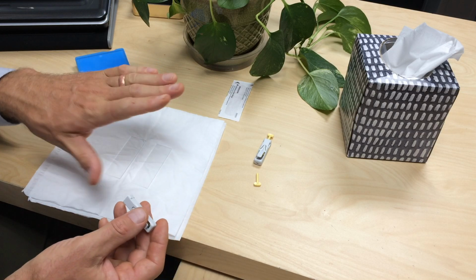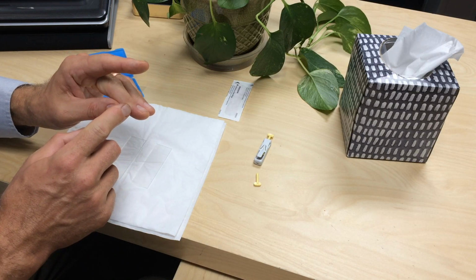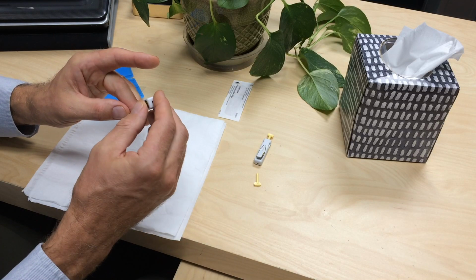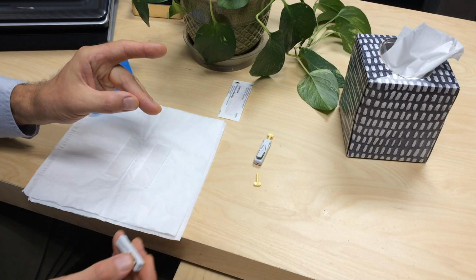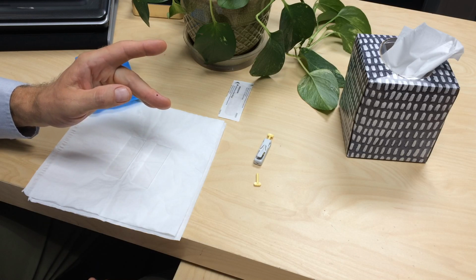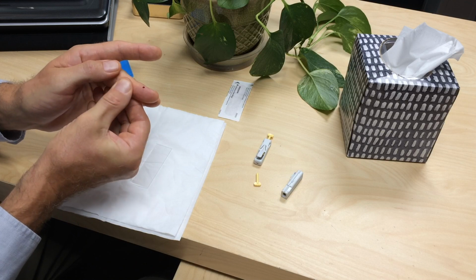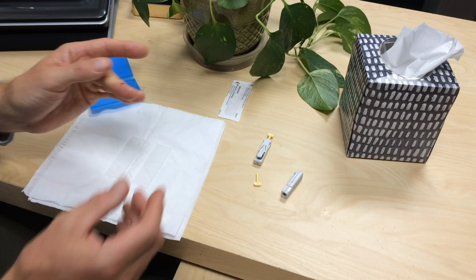So now at this point in the procedure, you take your left hand, your middle finger, and right about where the nail meets the base of the finger, a little bit in, is the perfect spot for this procedure. You take the lancet, apply a little bit of pressure, and then you're going to press that little button, at which point a little blood will begin to appear. We wait for that blood to form a bubble. If you're not getting much blood, you can gently coax it down the finger, applying a little pressure, but don't squeeze hard around the finger. We want a little bit of blood there.